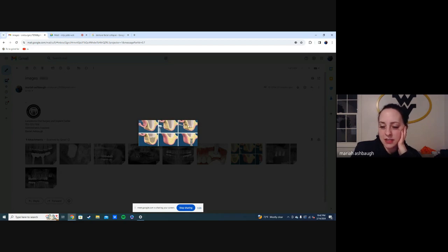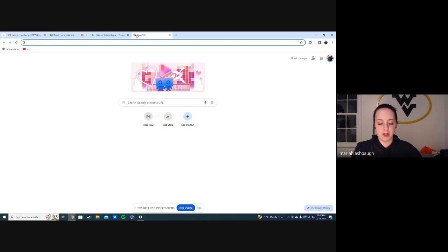So this outside bone layer is going to be the shell of your egg, and this inside layer here is that thin layer that you have in a hard-boiled egg. So you use that flap. That flap now becomes the top surface here, and then you pack bone into this hole, and that's where you get that little hump, and then you place your implants.